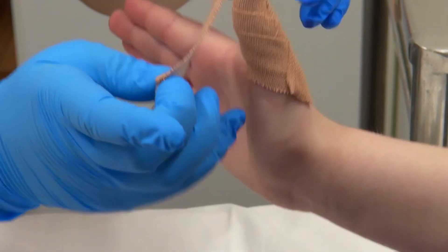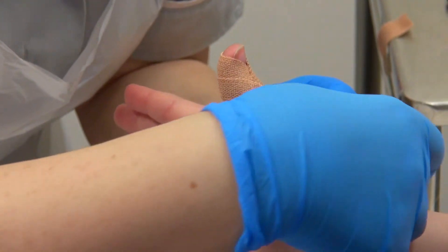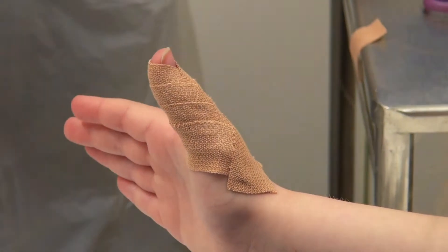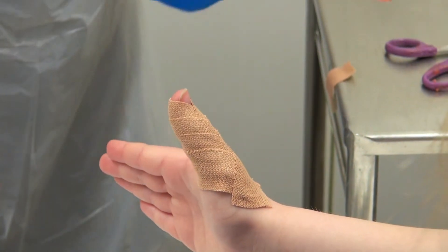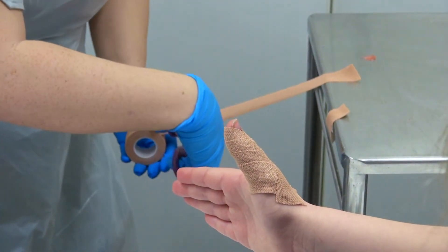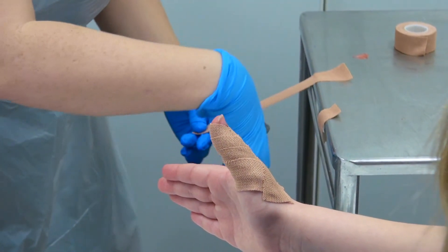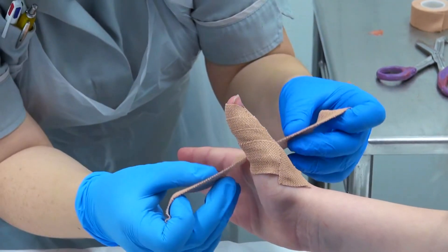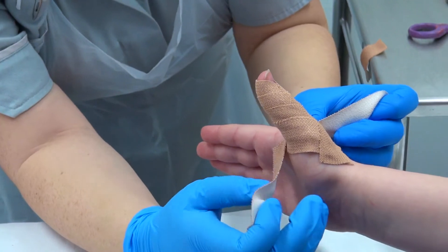Just cross it round, round the front, and thumb up nice and straight. And just cross it round, round the front. Then you want to cut it so it's in the crease.